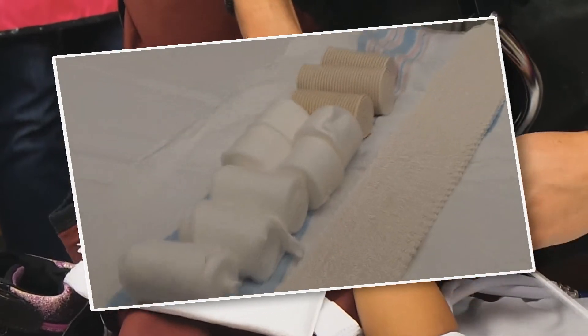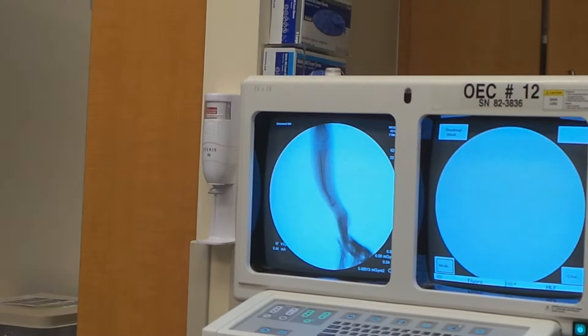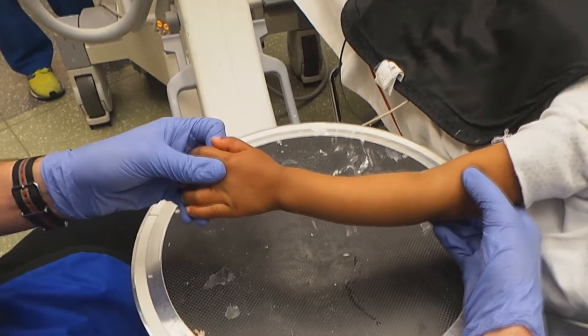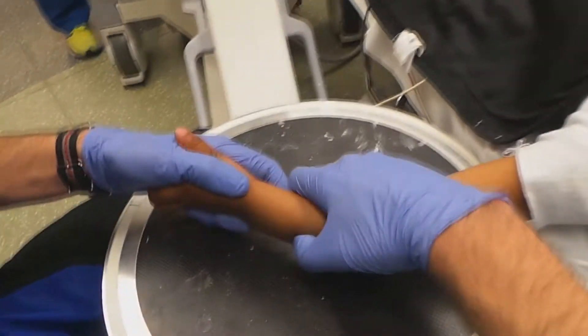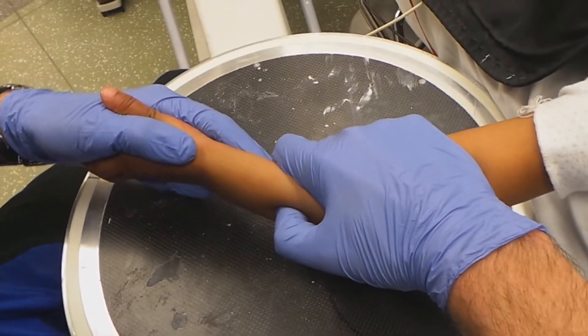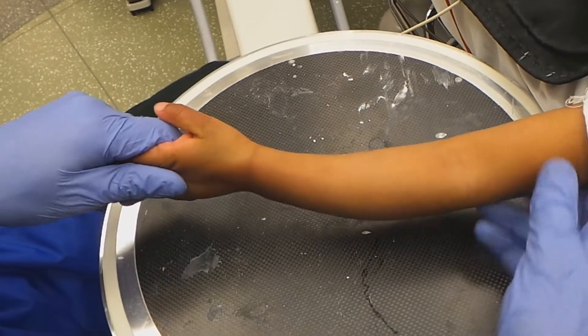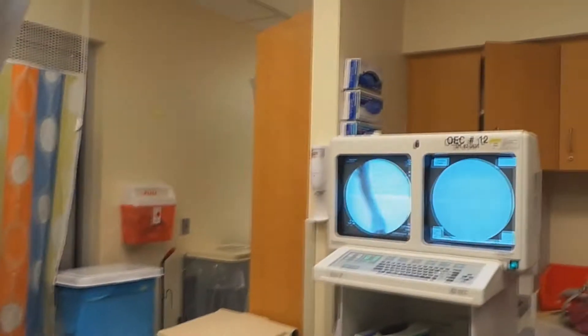So a milligram per kilogram of ketamine going in. That one actually looks good. And picture right there. That's primarily apex dorsal deformity. Just going to give it a little push. Picture. Picture. Picture there.